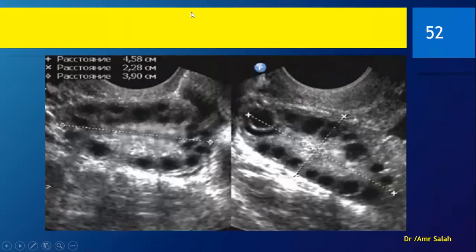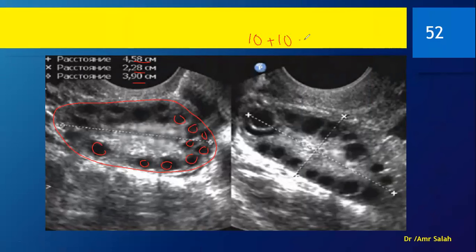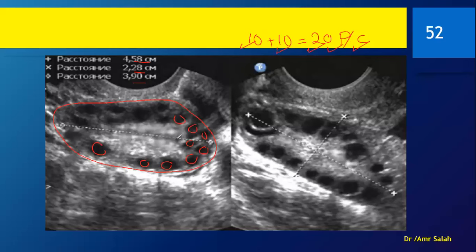Another example: the ovary here is enlarged, with dimensions more than 10 cc. The follicles are most likely less than 10 mm, their number most likely 20 or more, arranged in the periphery. The central stroma is devoid of follicles — you might find one or two, but most are in the periphery. The central stroma is echogenic. This is again a polycystic ovary appearance.